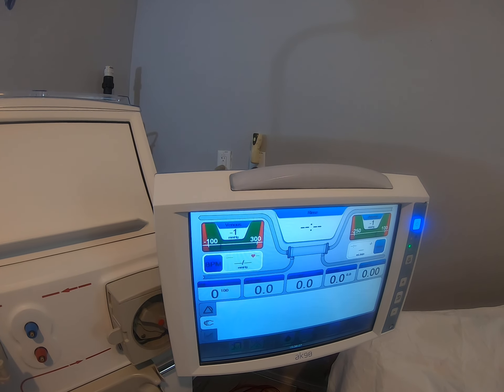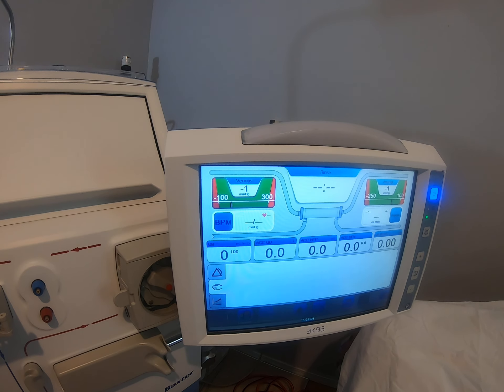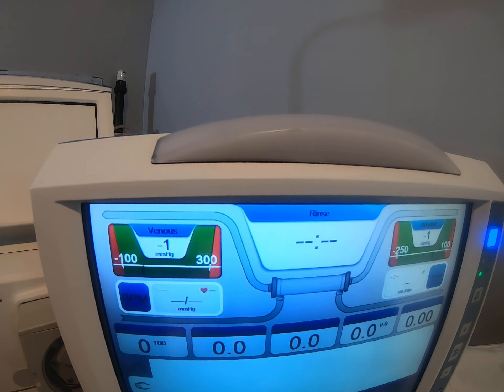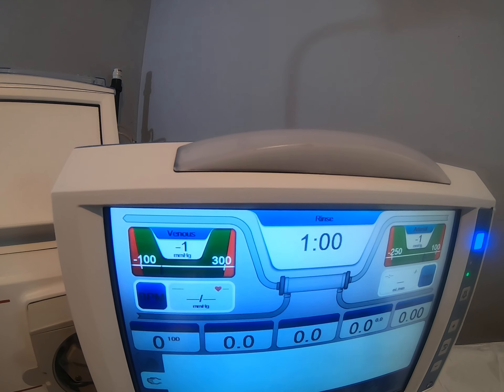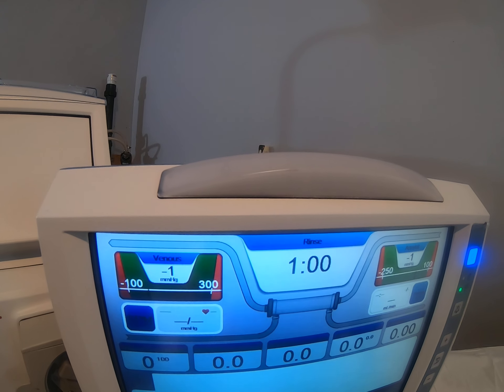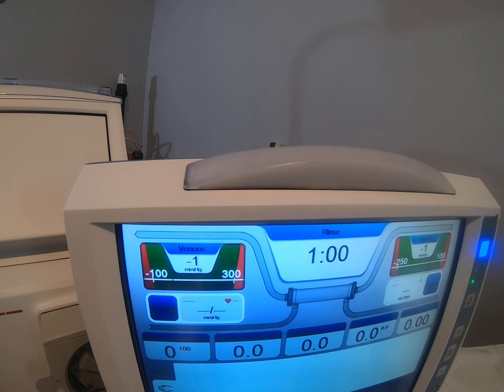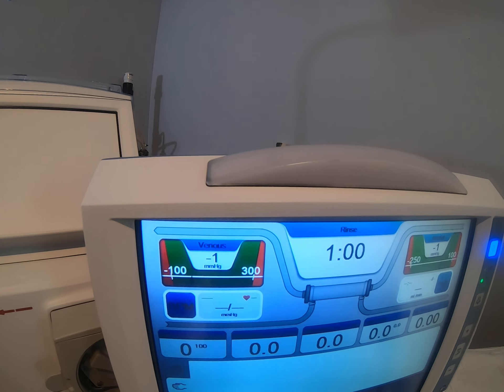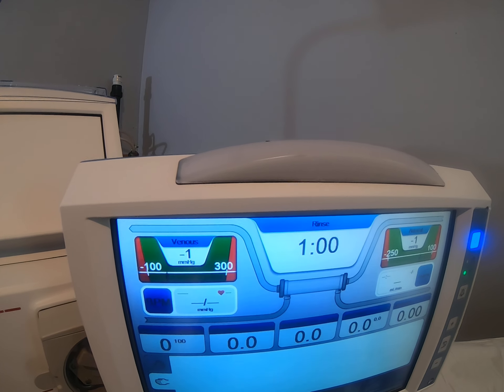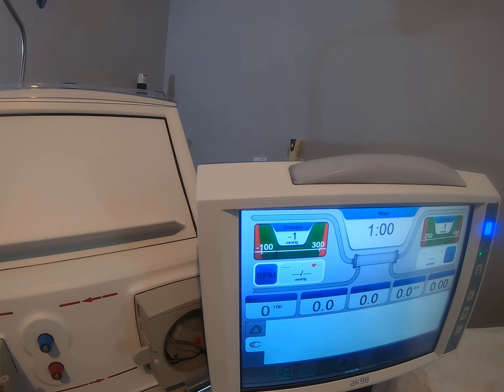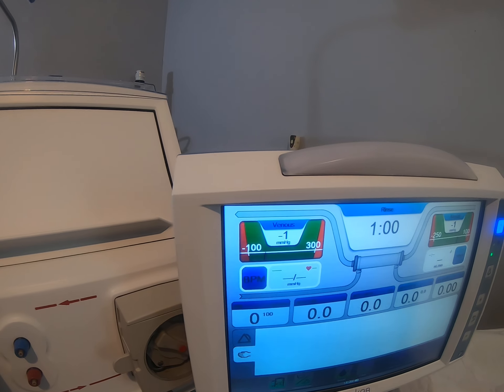It takes a while. Now we have a countdown here of one hour. It shows a one-hour countdown, and once we reach 10 minutes we can do our chlorine check. For the purpose of demonstration, we're not going to wait for 10 minutes — maybe after two minutes we can do our chlorine check.